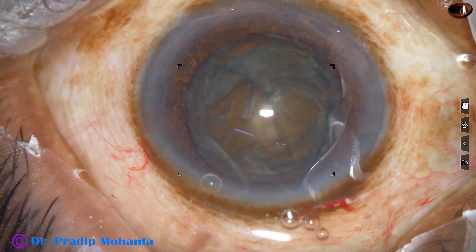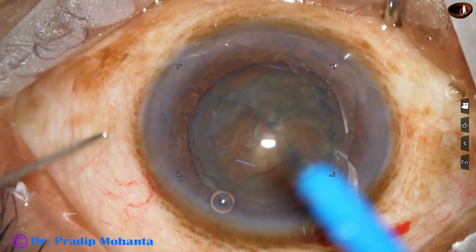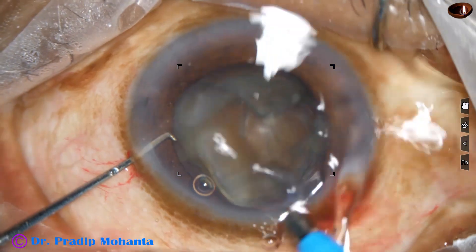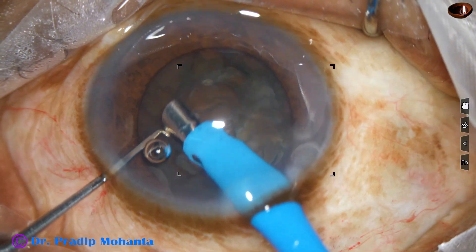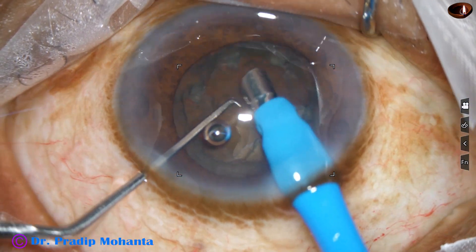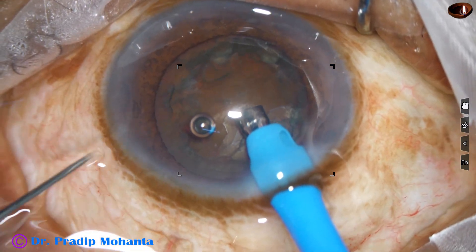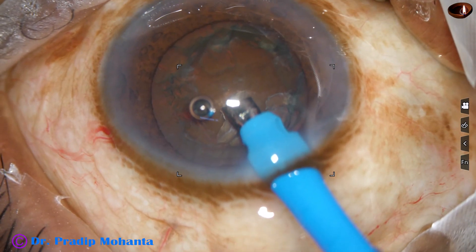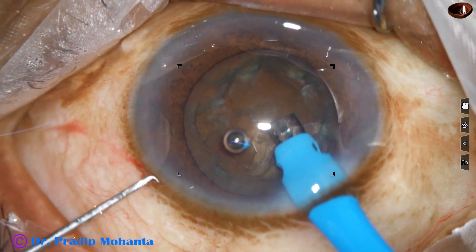Now is the time to introduce the phaco needle into the anterior chamber. The machine is the Alcon Infinity Cataract 3, and the microscope is OMS-90 from Topcon — no financial interest. Some superficial lens matter is aspirated, and then the handpiece is turned to make the bevel up. The chopper is used to push the nucleus slightly down.